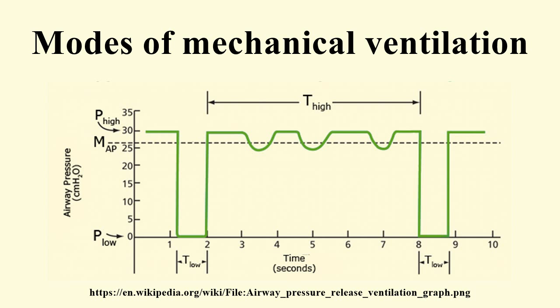High-frequency ventilation. The term active refers to the ventilator's forced expiratory system. In high-frequency oscillatory ventilation, the oscillation bellows and piston force positive pressure in and apply negative pressure to force an expiration. High-frequency ventilation. The term passive refers to the ventilator's non-forced expiratory system. In a HFVP scenario, the ventilator uses pressure to apply an inspiratory breath and then returns to atmospheric pressure to allow for a passive expiration. This is seen in high-frequency jet ventilation, sometimes abbreviated HFJV.